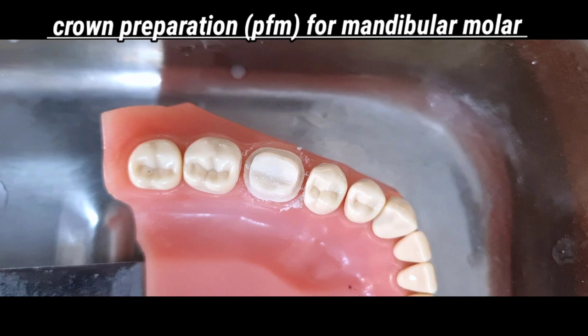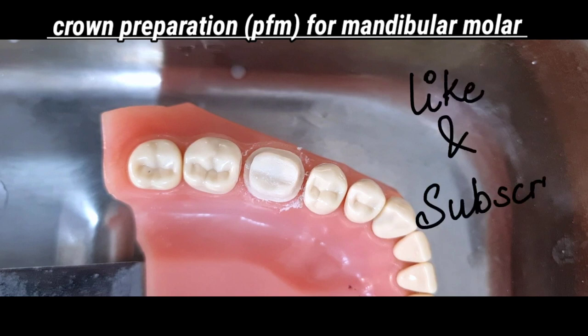The crown axial wall height should be more than 4 mm. There should be a continuous margin that follows the gingival contour, so the margin should be smooth and well defined. There should not be any damage to the adjacent teeth, and there should not be any sharp line angle or point angle. Each wall should have a 6 degree taper. And there should be open contacts with the adjacent tooth. So this is about the demonstration of a PFM crown on a mandibular molar.